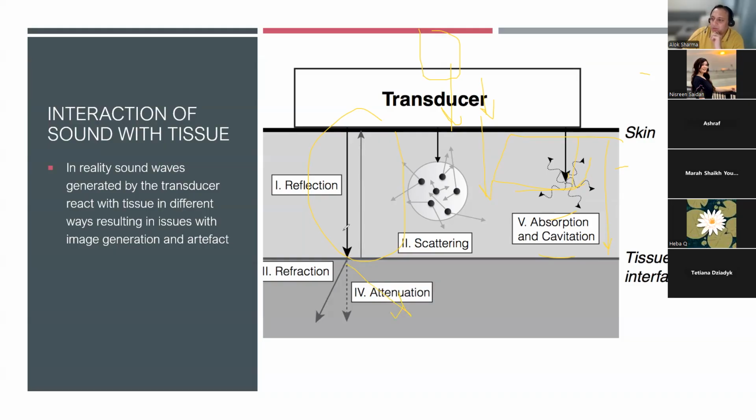Now, if sound waves refract a lot, then naturally they're not going to be able to reflect back to you. And there is a problem there, that you get refraction, which causes those sound waves again to give you an image that is best, bright in the center when your probe is perpendicular, as opposed to if your probe is kept at the margin.